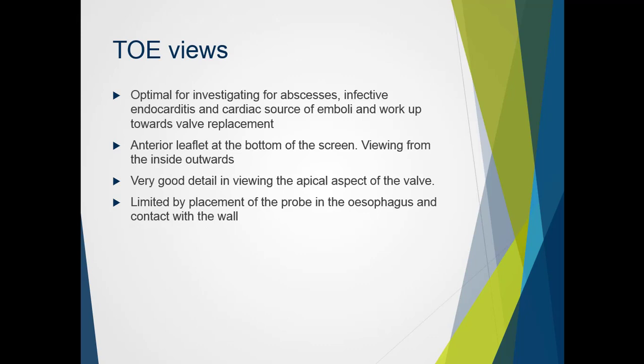Transesophageal echo windows are very good for obtaining information about the mitral valve. We use high frequencies which allow for greater spatial resolution. These are optimal for investigating for abscesses, infective endocarditis, and excluding cardiac sources of emboli, and also working up towards valve replacement. The anterior leaflet is seen at the bottom of the screen, viewing from the inside out. Views that mirror the apical long axis, apical two-chamber, and apical four-chamber are obtained.